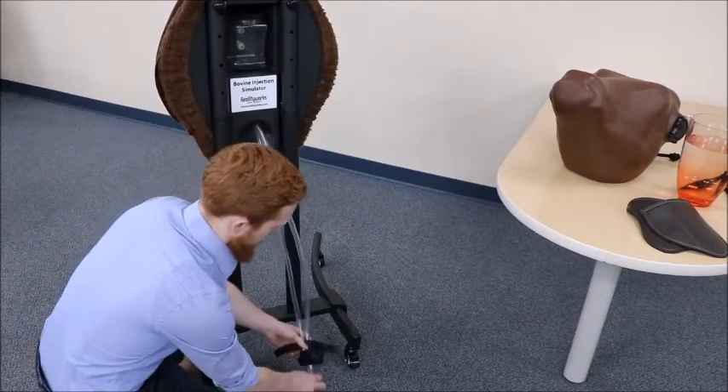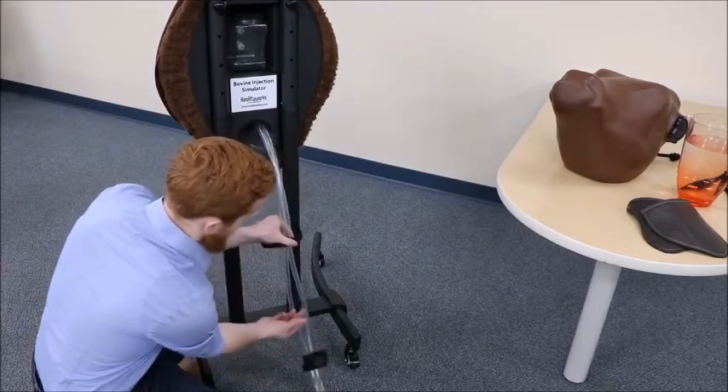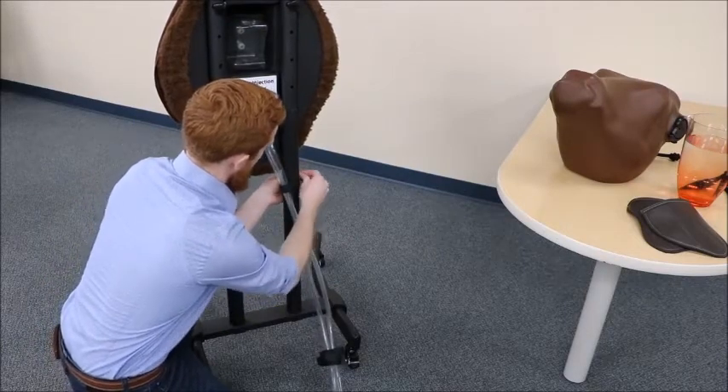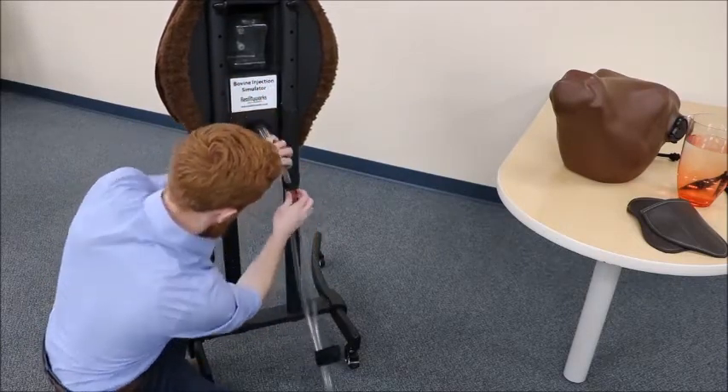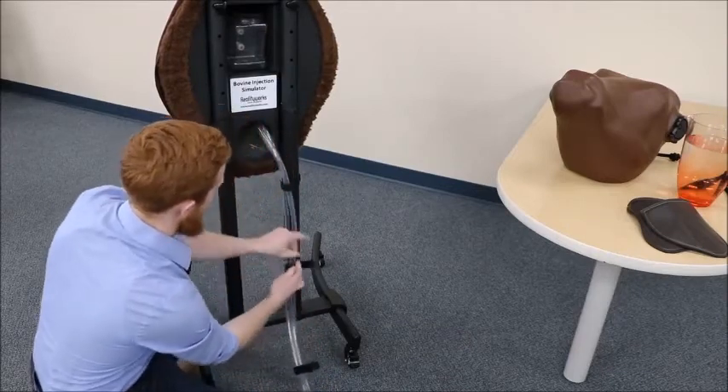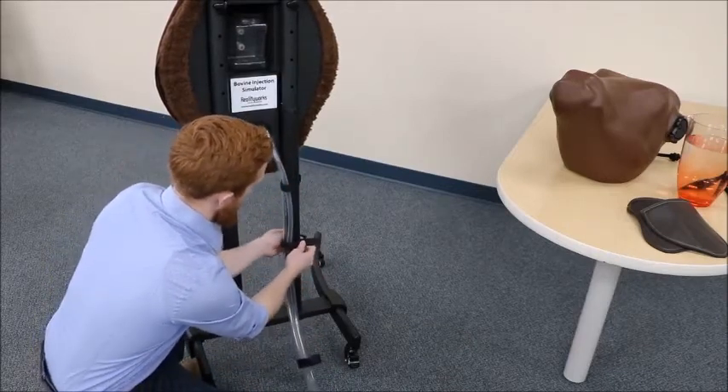There are three straps that hold the tubing from the foot pump to the uprights of the stand. We're just going to velcro them on so that they're securely attached but not too snug that it pinches off the tubing.